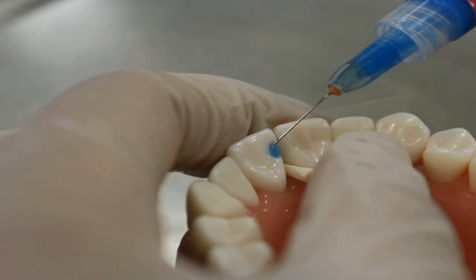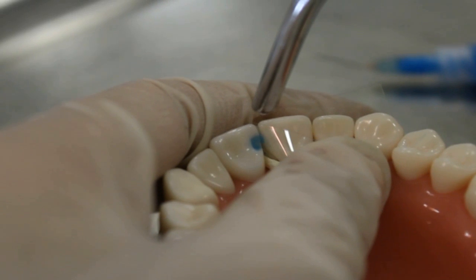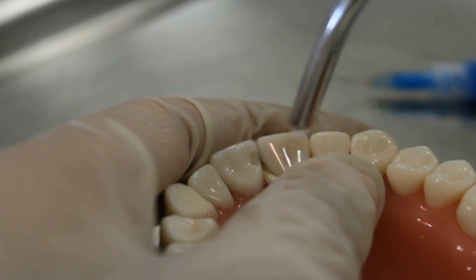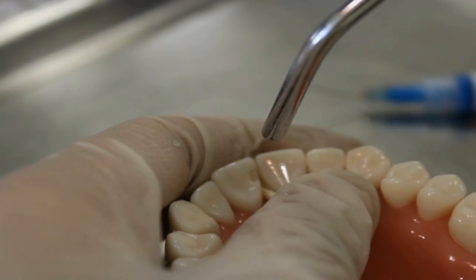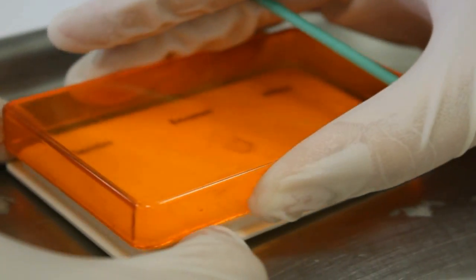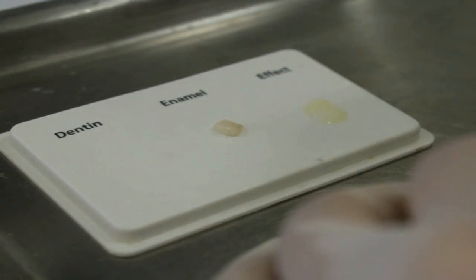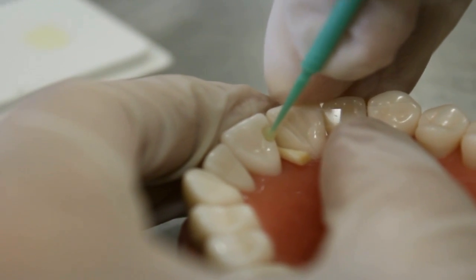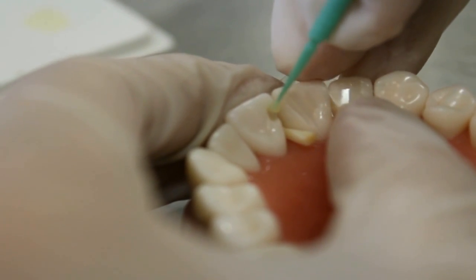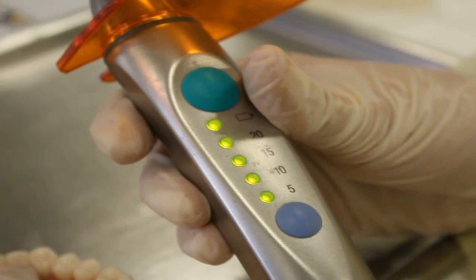Now we put the acid etching and try to cover the margin. Be careful to protect the adjacent tooth by placing a matrix. Wash it out and dry it in an intermittent way to prevent the collapse of the collagen. Now we apply the adhesive using an applicator. Try to coat every wall and line angle, but do not pool it. Dry it using air to have a thin coat, then cure it for 20 seconds.